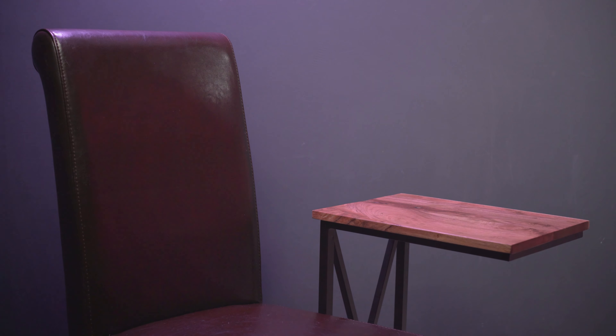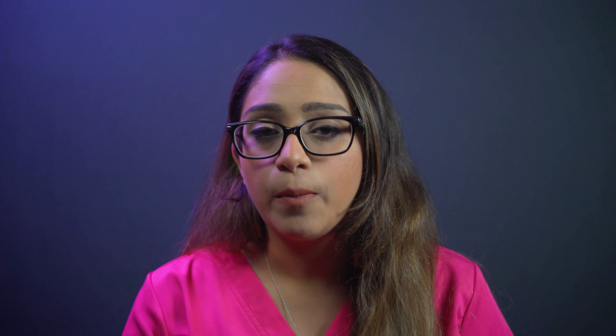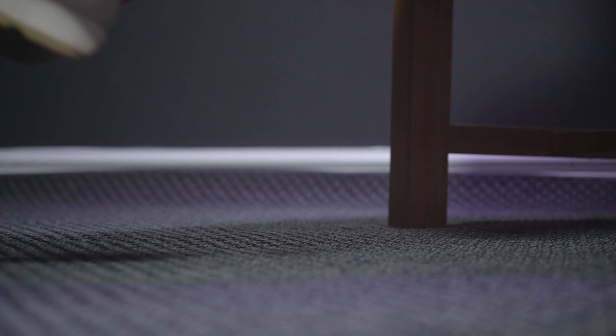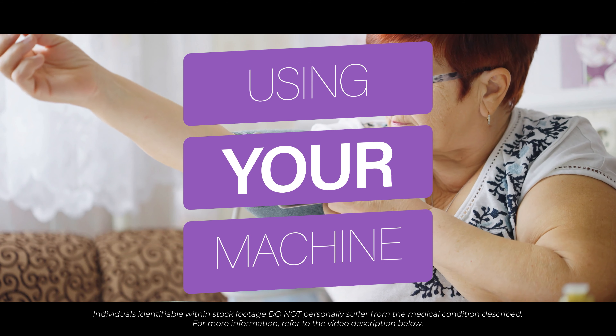In our example, we are using a side table. When measuring your blood pressure, it is important you remain relaxed. Try not to talk through the procedure. Sit upright with your back against the chair. Your arm should be suitably supported, and your feet placed flat on the floor.